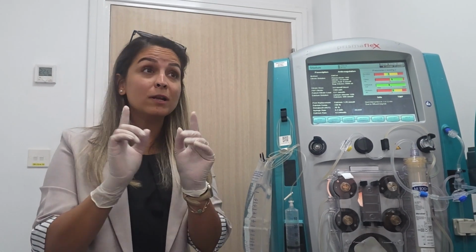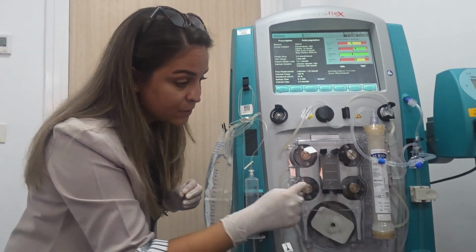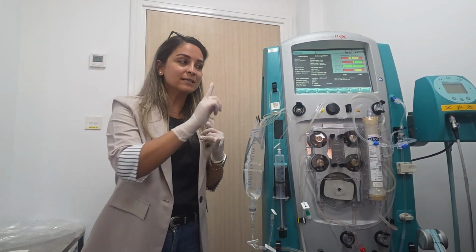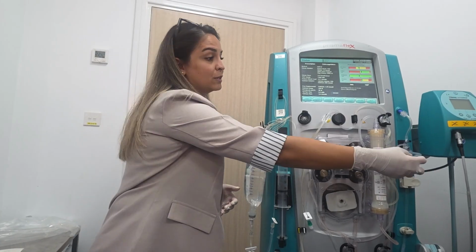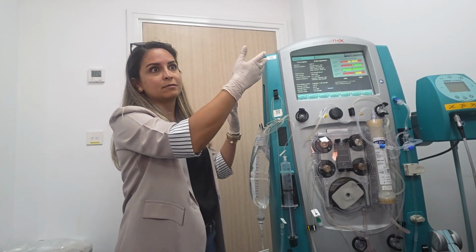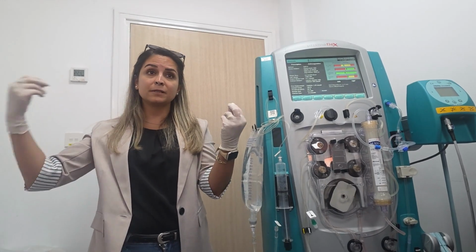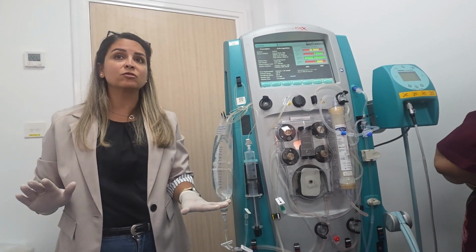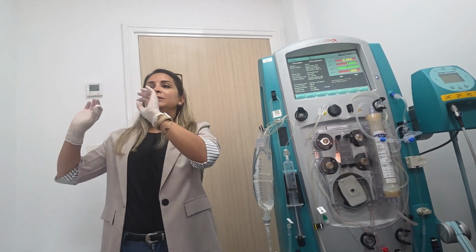One important thing, when you are taking the blood samples, all pumps should be running, no alarms. Because if there was an alarm about changing bags, there is no infusion of citrate. So when you take a sample, you will find the ionized calcium very high. Then you will change a lot, so this is not accurate. Please don't forget this. When you want to take both samples, either from patient or from machine, all pumps should be running, no alarms at all. Now, we took the 2 samples.